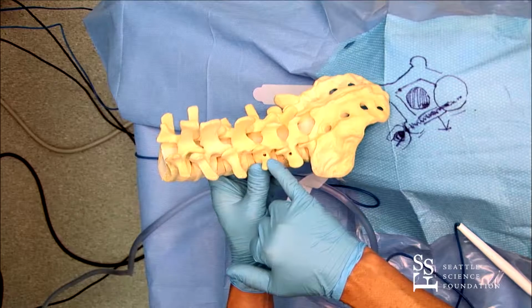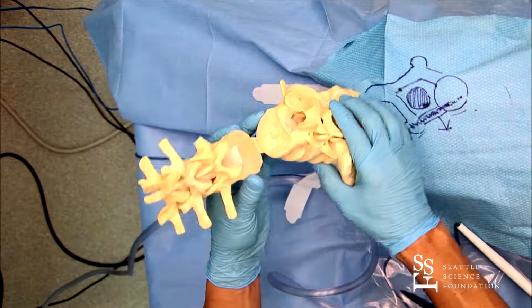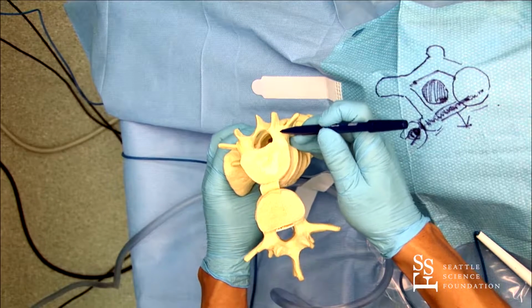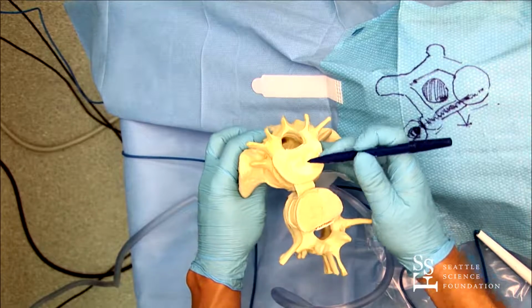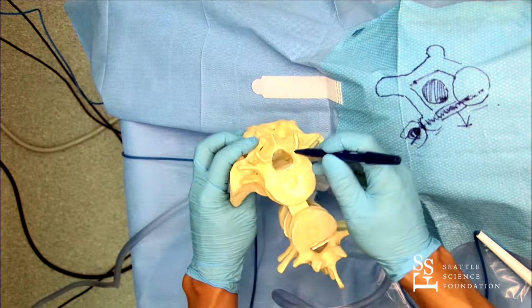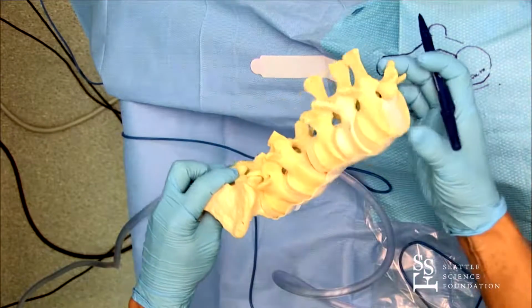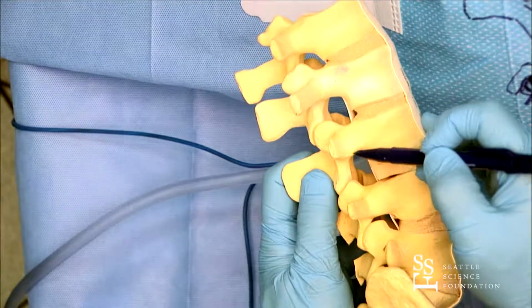So I don't know if you see these little holes. This hole is exactly where we're gonna put the screw, and the screw is gonna go down right in this pedicle. You won't see the screw, but we're trying to go right into this bone, right into the body. And so here is the spinal canal. This is where the nerve roots are. And so this is our window. We're gonna put two screws here and here. And if you look at the side, through this little column of bone.